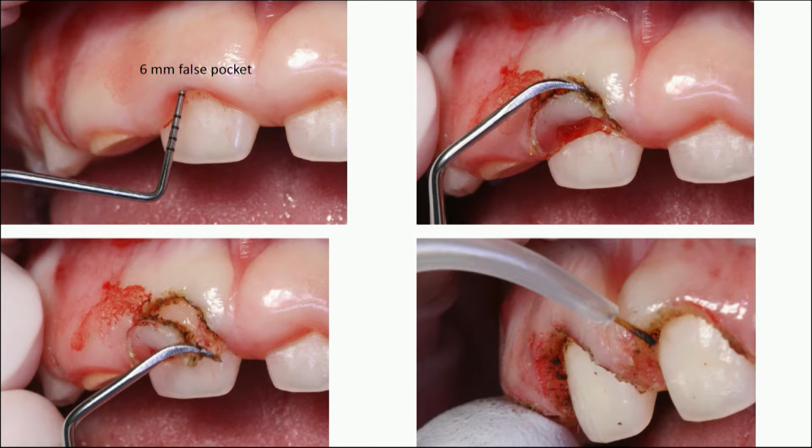What we basically did, you can see on the upper image, is put in the periodontal probe to measure the amount of tissue which is there. You can see that up the top over here. Then we've used the laser to do a little incision to select the tissue. And this is a really important point with a diode laser. You don't have to erase tissue by stroking it like you saw in the previous case of the cervical lesion. You can actually just use it, in this case, just like a scalpel, and cut the physical piece of tissue away.